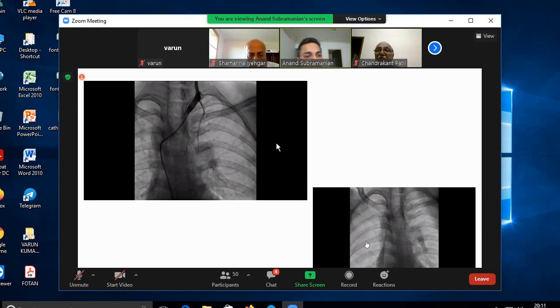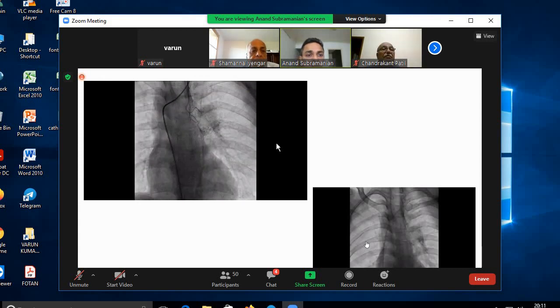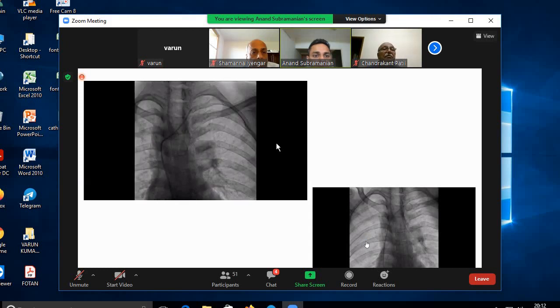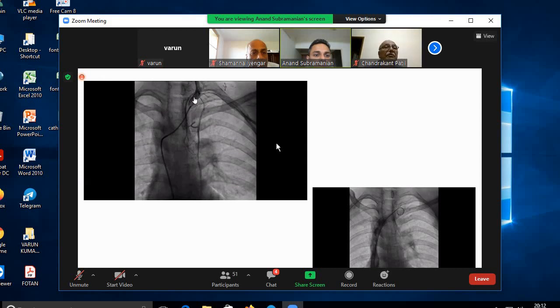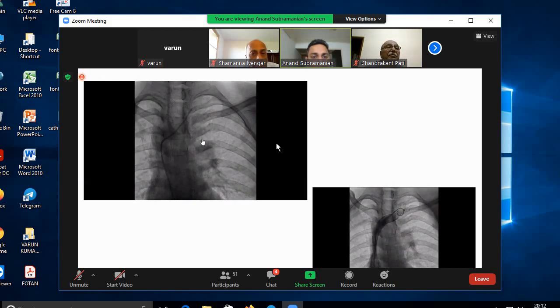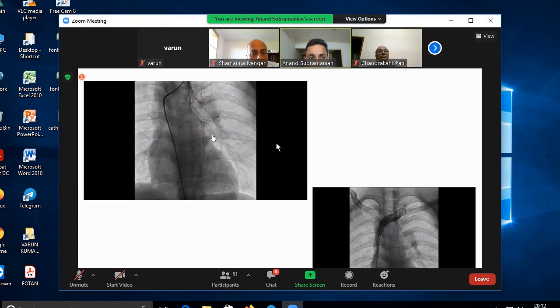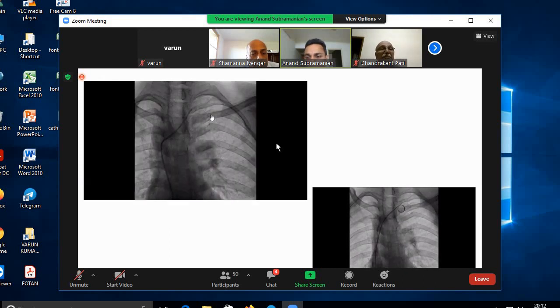Now, if you look at the next angiogram, again we have looked at the Lima shoot. And again, you see that you don't have too many collaterals. Here, the Lima is not very hypertrophied or enlarged as it was on the right side. But you see, again, a small leash of collaterals from the basal portion of the left subclavian. If you see the arborization, they really don't arborize much. They are all very minute vessels within the lung parenchyma. These are not surface collaterals; these are collaterals going to the lung parenchyma. But again, very small in size, so probably not of much concern in the post-operative period or to the surgeon.